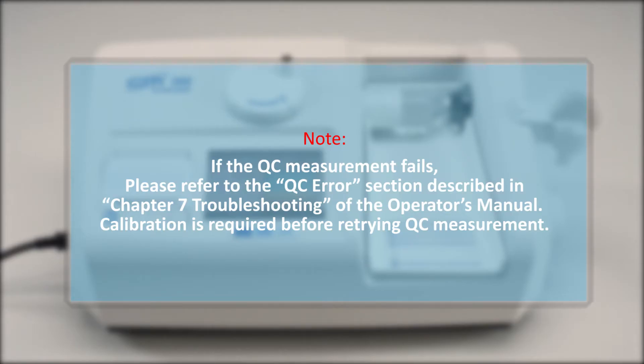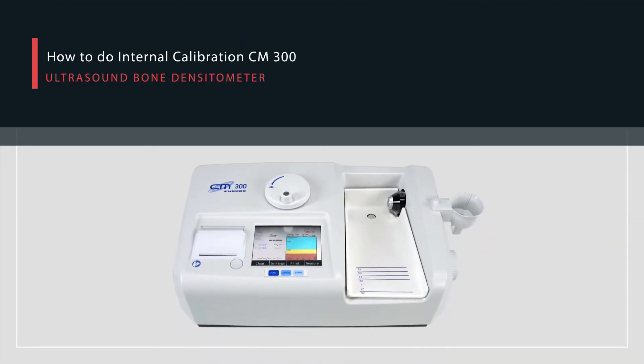Note: if the QC measurement fails, please refer to the QC Error section described in Chapter 7 Troubleshooting of the Operator's Manual. Calibration is required before retrying QC measurement.